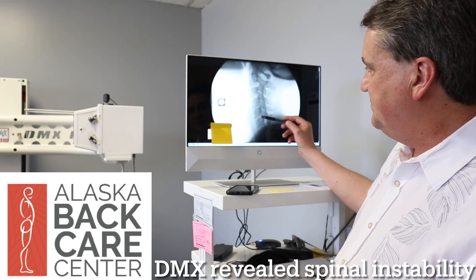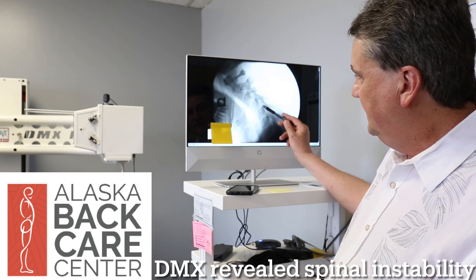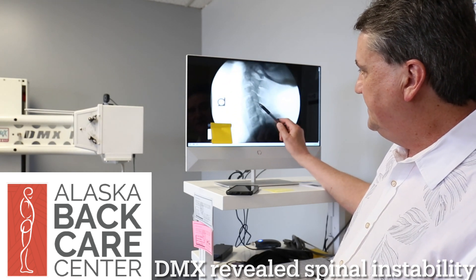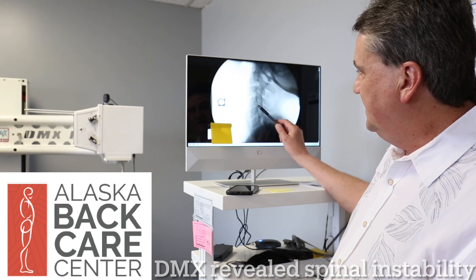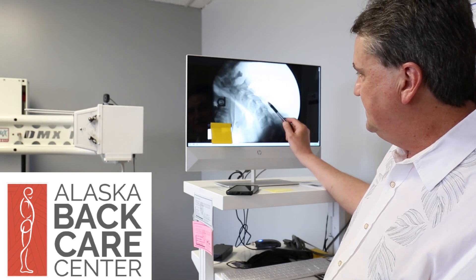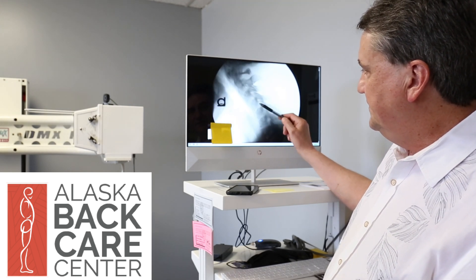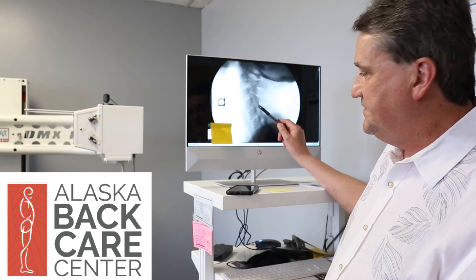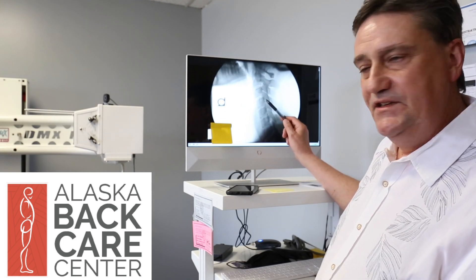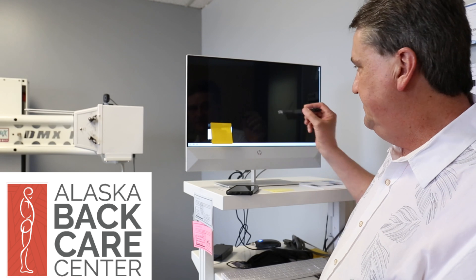In extension it comes back to normal range, but when she goes into flexion it really opens up back there. That depicts ligament damage in the posterior longitudinal ligament and the interspinous ligaments. In the further views we have here, she also has capsular ligament damage in the facet joints, which is a major pain generator.